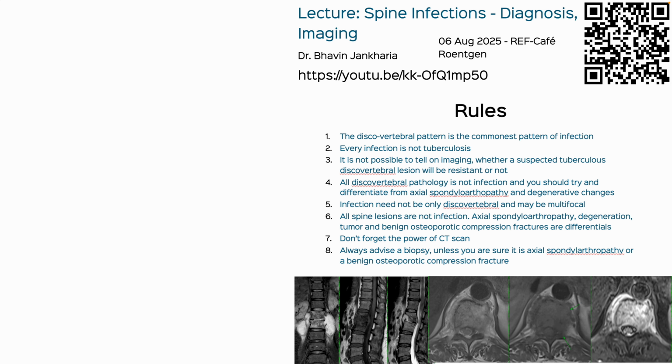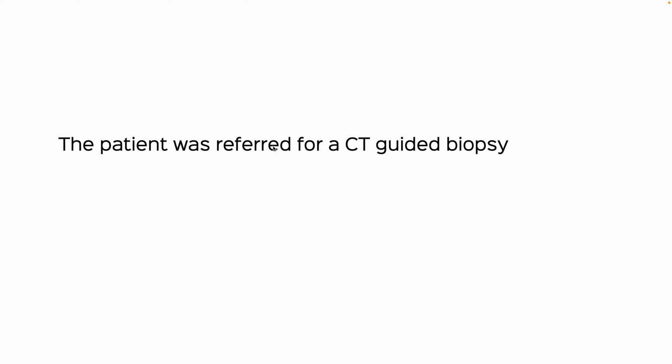And while there may be other possibilities, this pattern of disease is most commonly seen with an infectious spondylitis. And this lecture is there. I think I put this up about 2 or 3 weeks ago, and it covers all of these issues as to why this particular pattern would be infection.